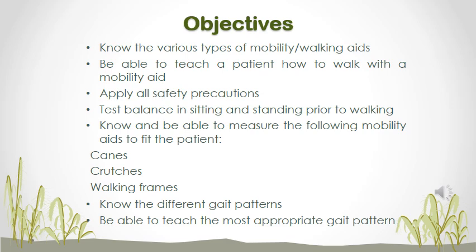Apply all safety precautions before and during walking a patient by using mobility aids. Then you should also be able to test the balance both in sitting and standing to make sure that the patient is ready to start walking safely.